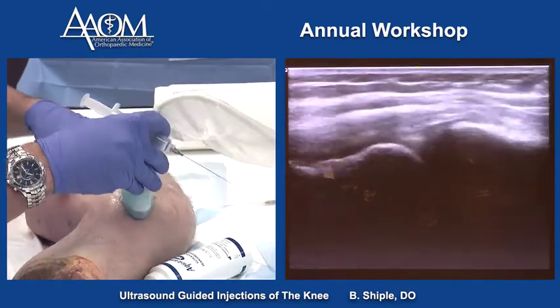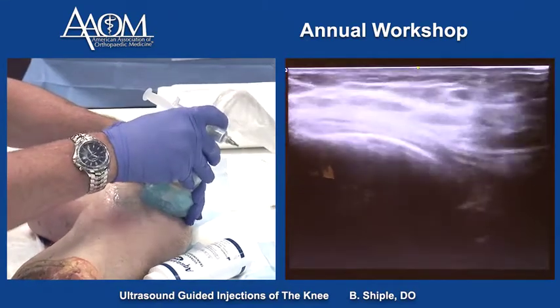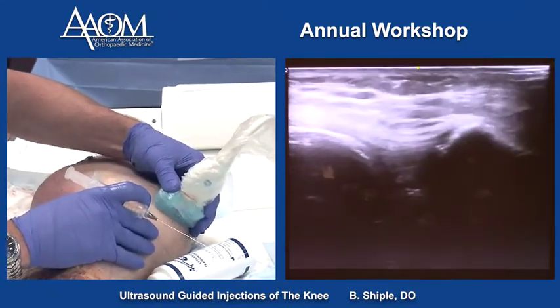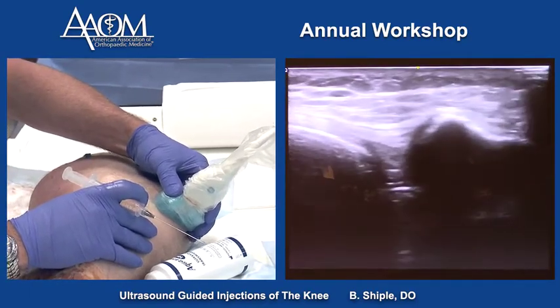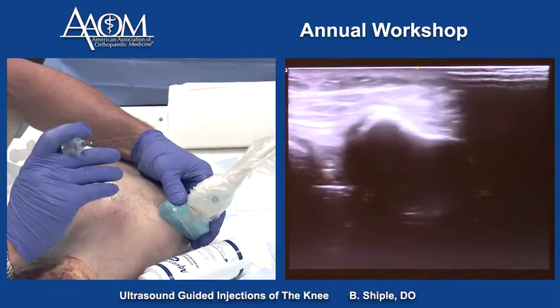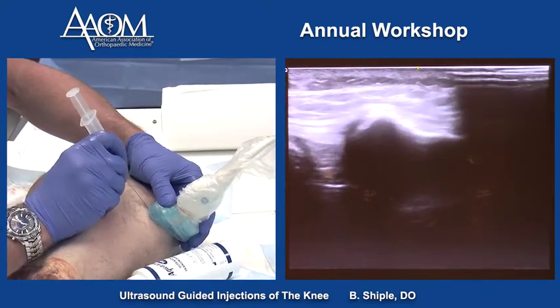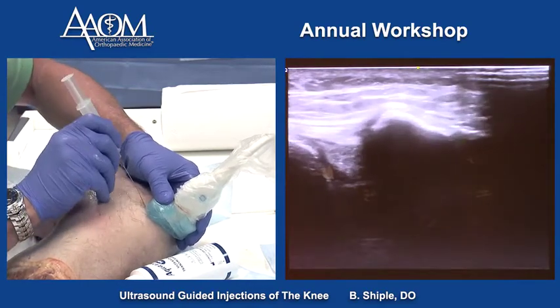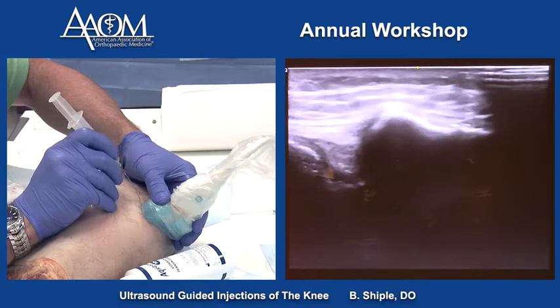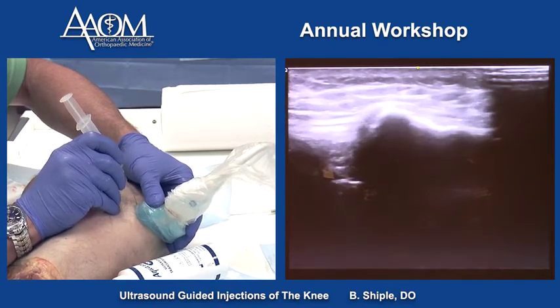We can also inject the MPFL on the medial patella. There's the patella, and that's the MPFL right there. We'll slide the probe away to get that target closer to the probe and go in long axis. And that's it right there.